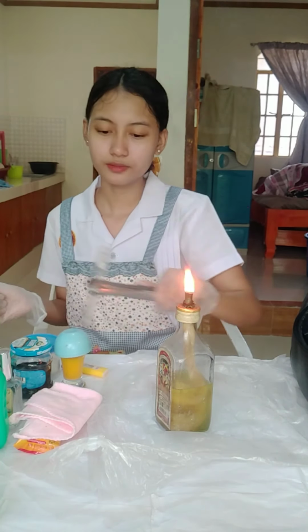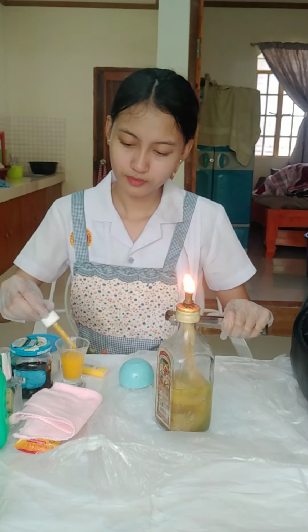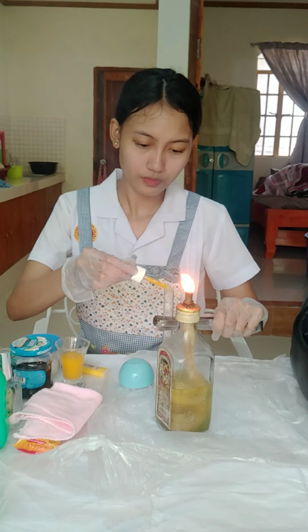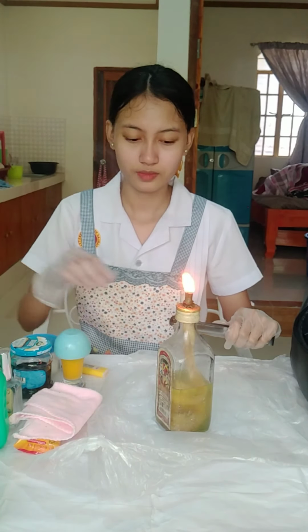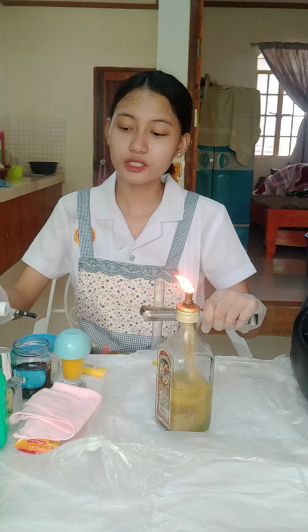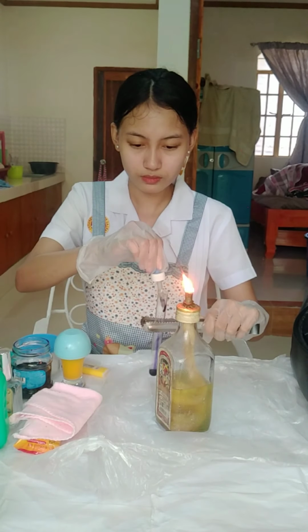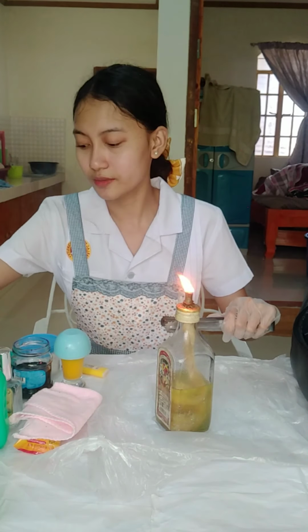After that, we need to place 6 to 8 drops of urine in the test tube. Then put it on or near the waste receptacle. And then after that, we need to add 3 to 5 ml of Benedict solution using a dropper. Assuming that this is 3 to 5 ml of Benedict solution. And then place it near the waste receptacle.